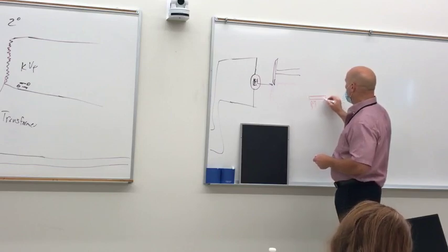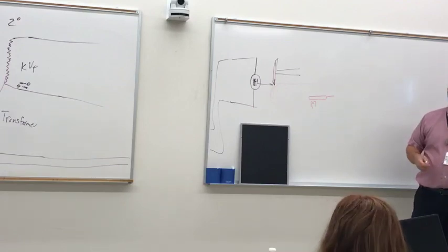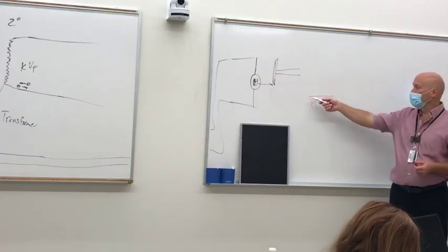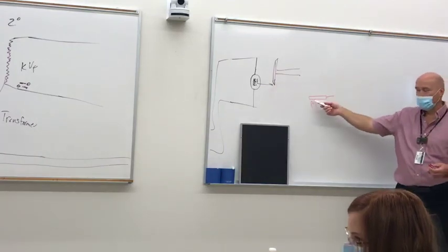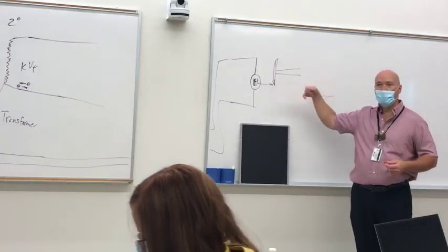Is the whole pan going to get hot? Well, eventually. But what part's going to be the hottest? The closest one to the flame, directly over the fire. That right there. So if you move the pan around, you save some of the heat to the overall pan, or to this area, right? Same principle. We're going to take this thing, we're going to spin it around and around.